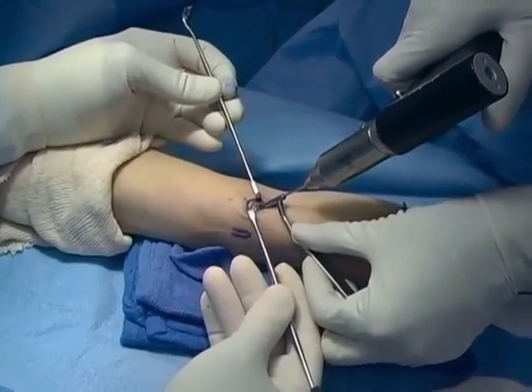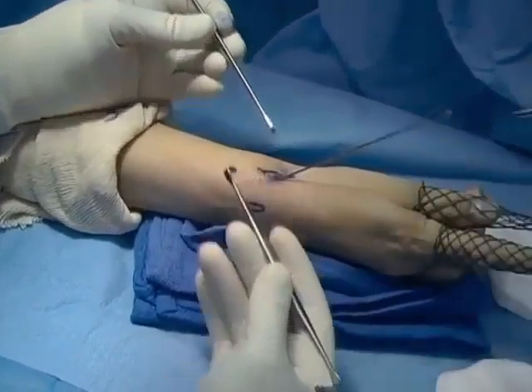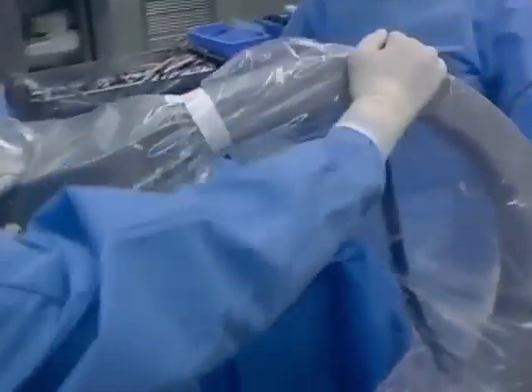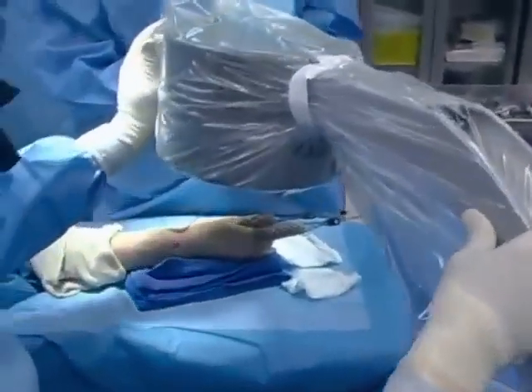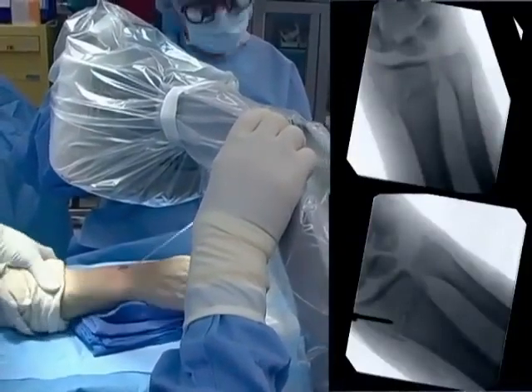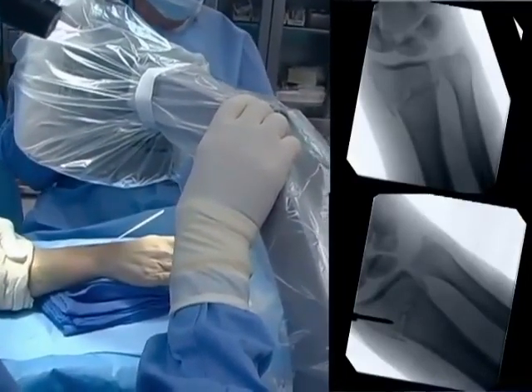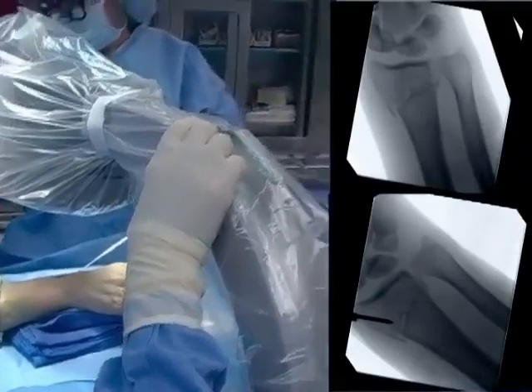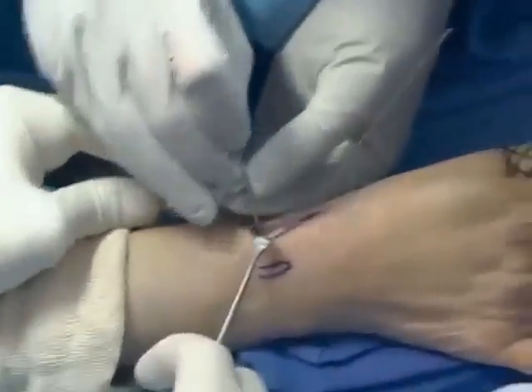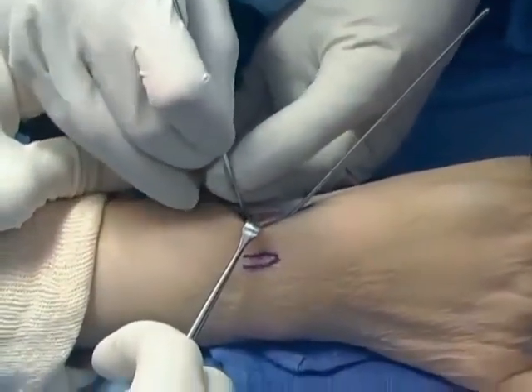After the pin is initially placed, we check our reduction and if any further manipulation needs to be done, it's done at that time, and then the pin is driven across the fracture. The C-arm is brought into the field confirming the reduction. In this case, there was some residual radial translation of the distal fracture fragment. You can see the pin in the distal fragment, not across the fracture. An intrafocal pin is placed into the fracture to correct the radial translation.